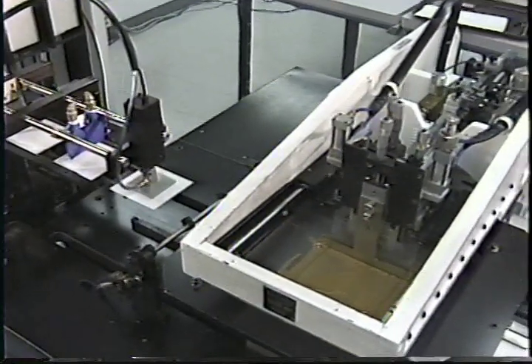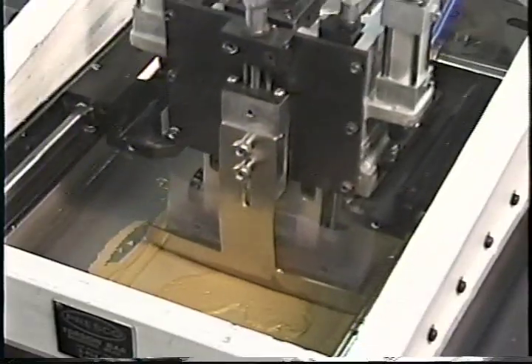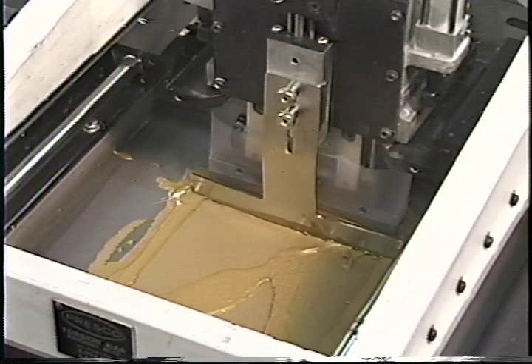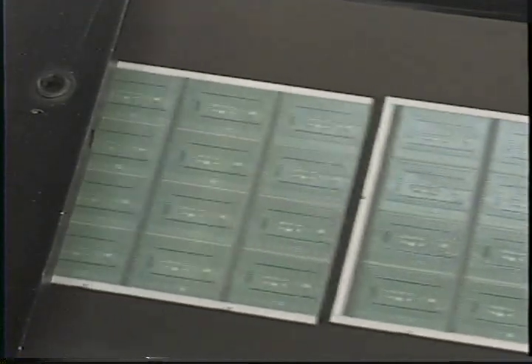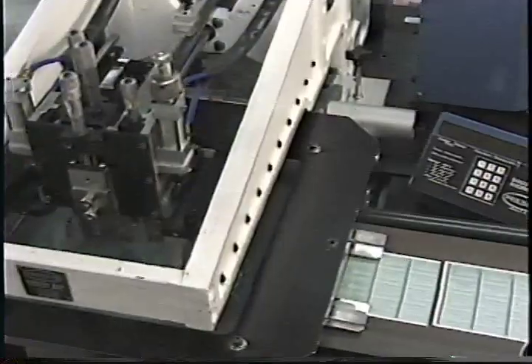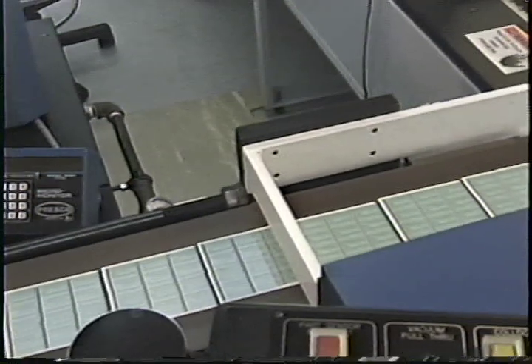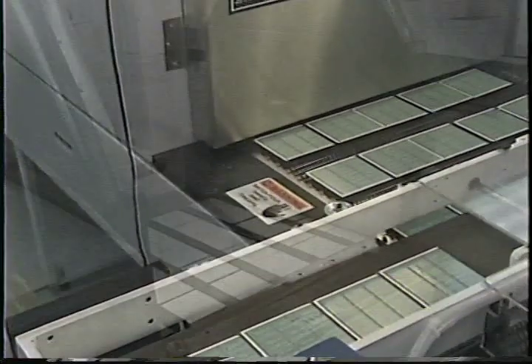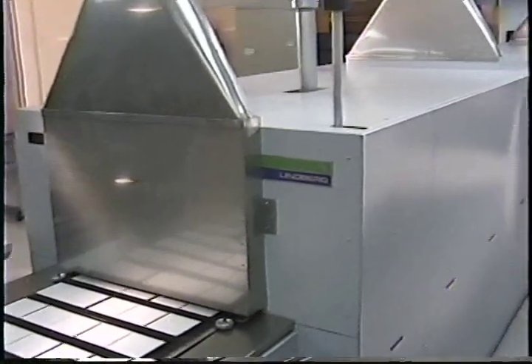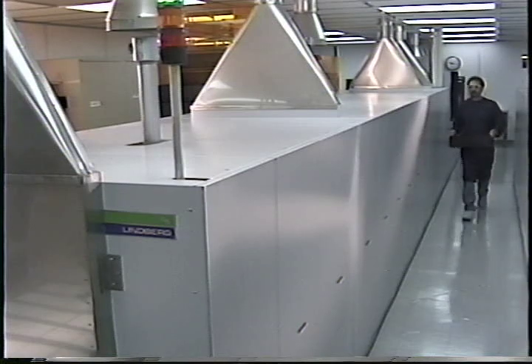Using a 4x4 ceramic panel, 12 individual chips are created using 4 different materials: gold, silver, resistor, and 2 to 3 layers of dielectric used as insulation layers. After each material is screen printed on, the panel goes through a low-temp dryer to eliminate any organic solvents. Then it travels into a furnace and is fired at 850 degrees centigrade.